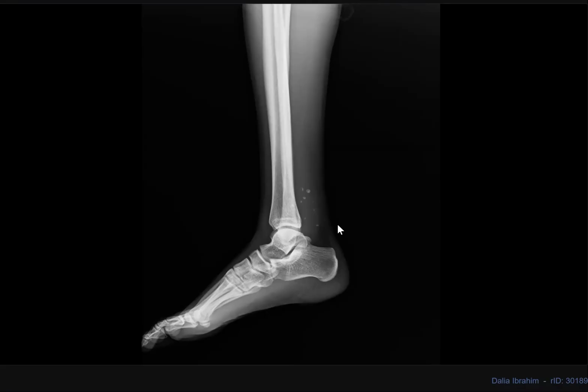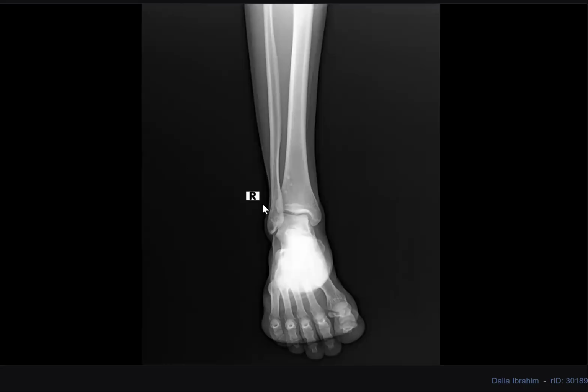For any radiograph of the skeletal system, please, my friends, mention to the examiner before you give the diagnosis: in my routine practice, I will comment on other orthogonal views before giving the final diagnosis. If he said there is no additional data in the other views, then give the final diagnosis.